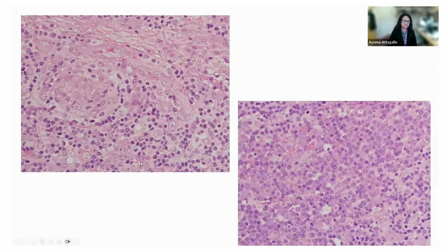I'm just going to show you a few slides only and just focus on this follicular structure here. You can see it's regressed, the germinal center here. The follicle center is a regressed follicle. And there's something going on in this mantle zone where there are some largish cells here. There's a large cell, and it seems to be also encroaching on the germinal center. So let's have a look at this a little closer. And in the interfollicular compartment, you're just seeing a sheet of mature plasma cells with this clock face chromatin.